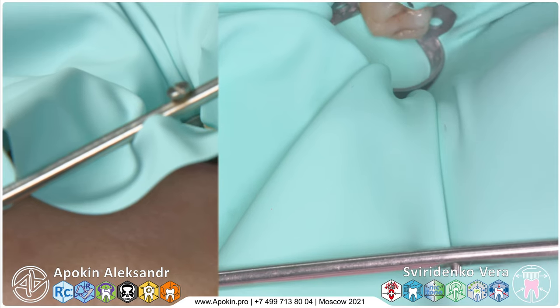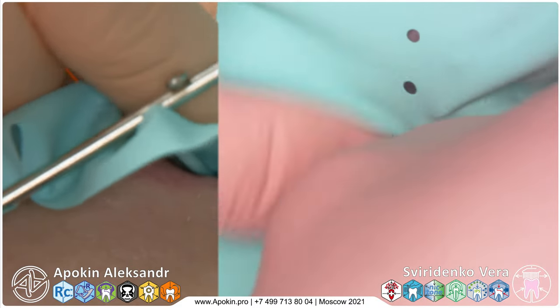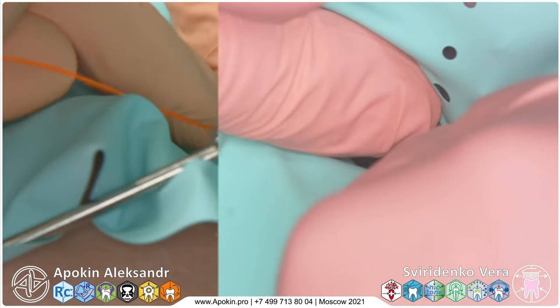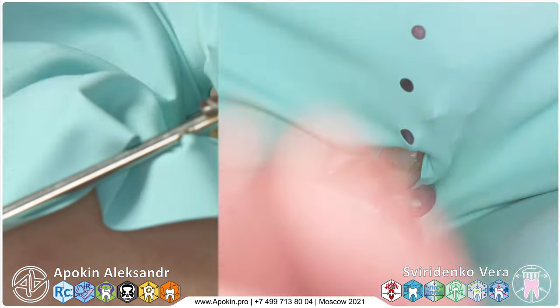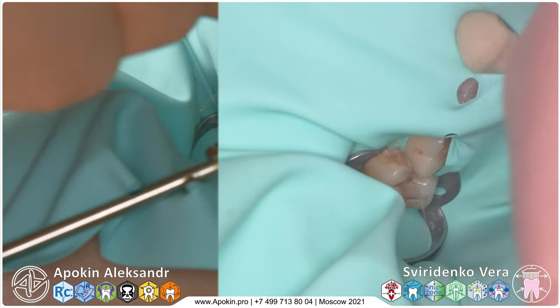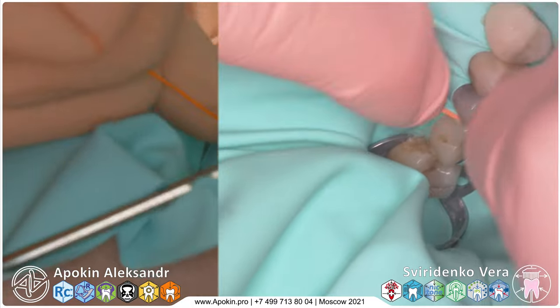When you're working with class 2, it is very important to make enough isolation, always plus one tooth distally, to have enough space to insert matrix, fixation rings or any additional accessories. Using floss very carefully, do not penetrate or destroy the interdental rubber dam parts. Use both directions, from mesial tooth and from distal, parallel.